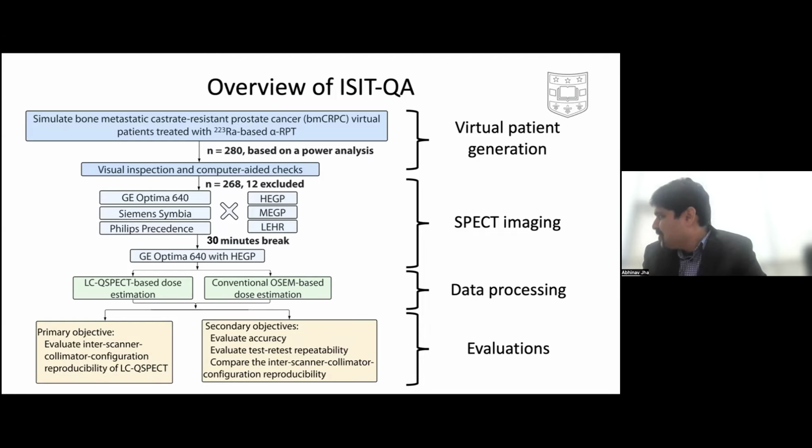So you did that again, using preliminary simulations to do your comprehensive study. Yeah. And so based on that, we came up with this number of n equal to 280. Really trying to emulate the clinical trial here, like, okay, 280 is the number. Now, in a clinical trial, and I think I'll maybe talk about this, let's see if I can.